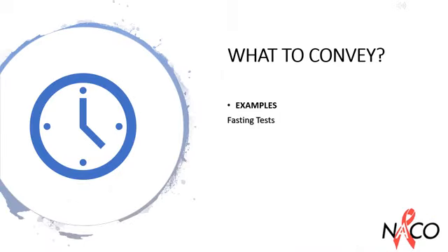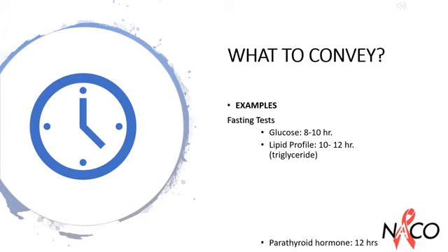It is important to inform the patient regarding tests which involve fasting. For example, for fasting plasma glucose, a fasting period of 8 to 10 hours is required. For lipid profile test, 10 to 12 hours of fasting is required. For parathyroid hormone, 12 hours fasting is required, depending on the analytical requirements.